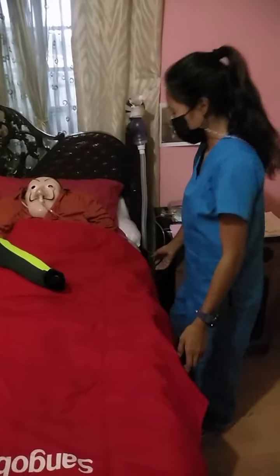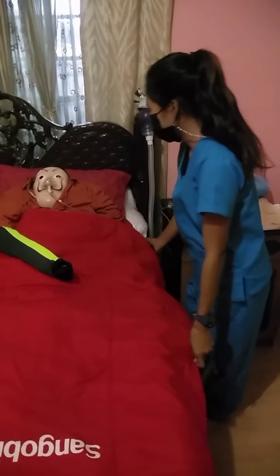Adjust the bed to a comfortable working height and lower the side rail closer to you. So position the patient. If conscious, place the patient in a semi-Fowler's position. If unconscious, place the patient in the lateral position facing you.